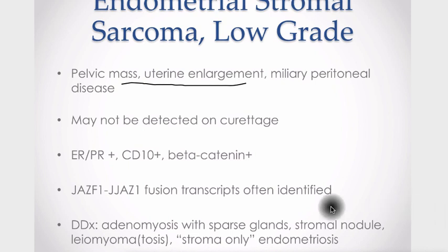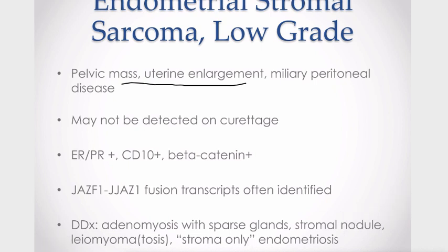The differential diagnosis includes adenomyosis with sparse glands, which we do see on occasion. An endometrial stromal nodule, although that's usually more superficial — a single focus without this pattern of myometrial infiltration. Cellular leiomyoma or leiomyomatosis, and possibly leiomyosarcoma can look like this. In the miliary type, stroma-only endometriosis can also be included in the differential.